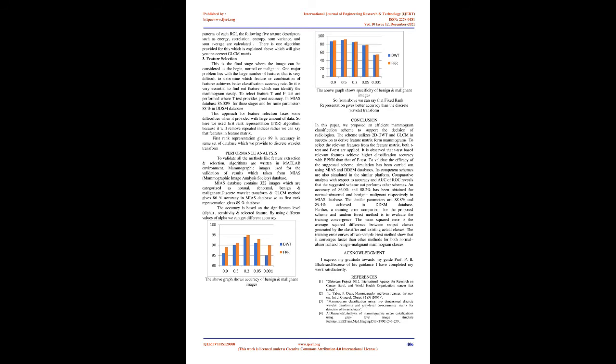The co-occurrence matrix of the ROI is used in classification of types of breast tissues by extracting descriptors from the matrix. There are 2 types of relationship developed between 2 pixels. One is the reference pixel and the other one is the neighbor pixel. Let Q(i,j) be the element and it is given by equation 2.